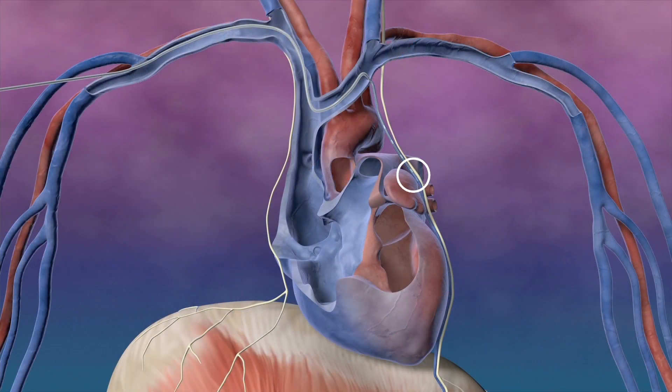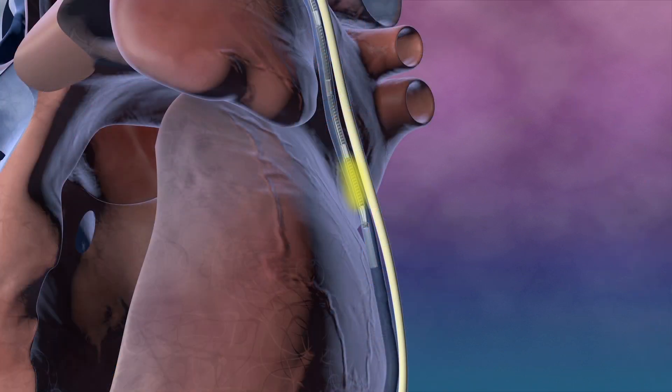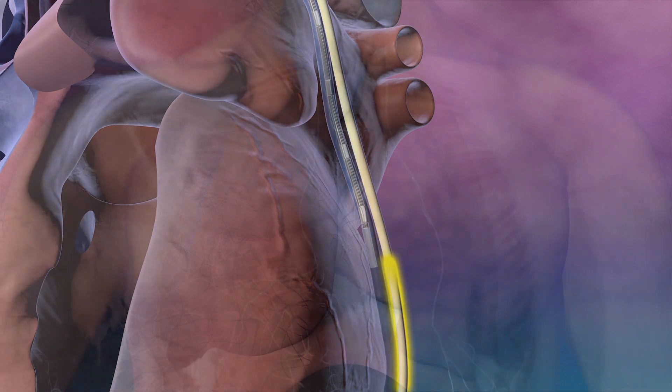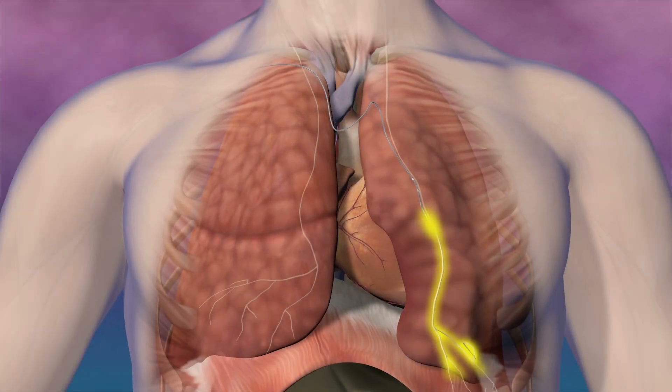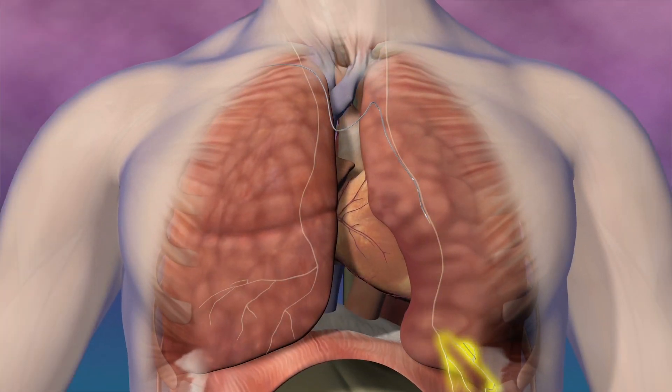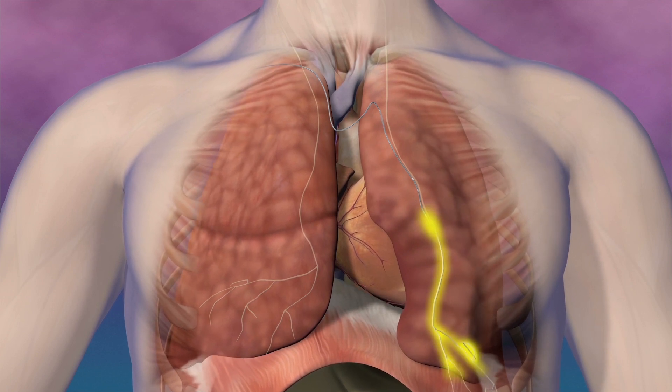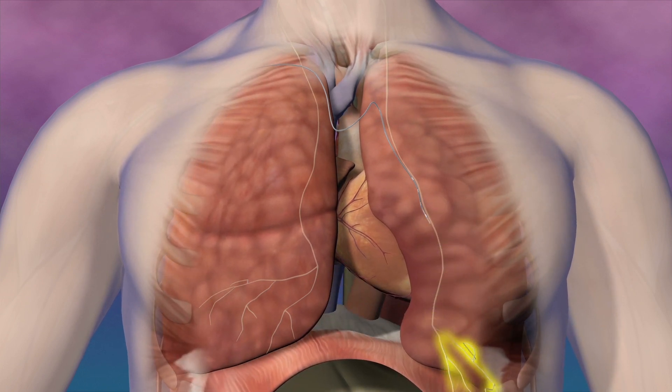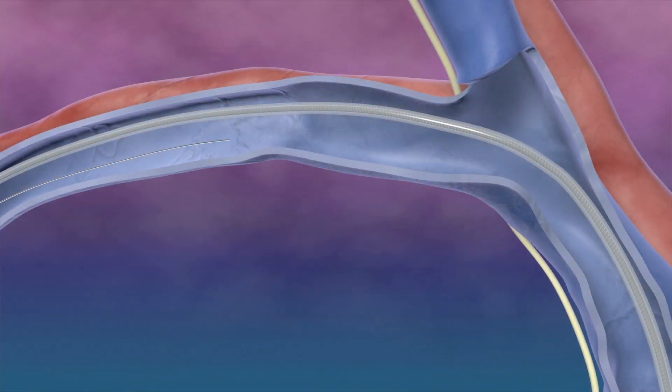The electrodes are now situated adjacent to the left phrenic nerve. This location is confirmed with electrical testing by observing a smooth, strong contraction using fluoroscopy. The guide wire and guide catheter are left in place to maintain lead placement during the rest of the implant procedure.